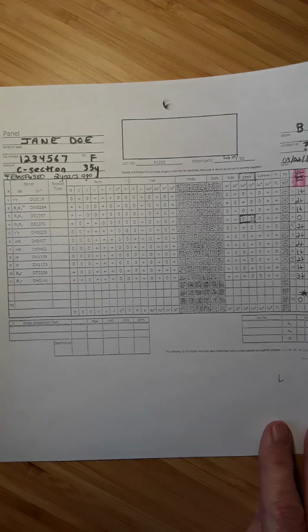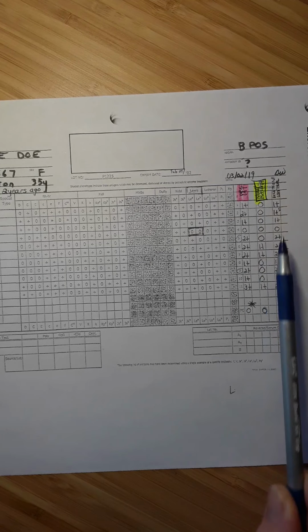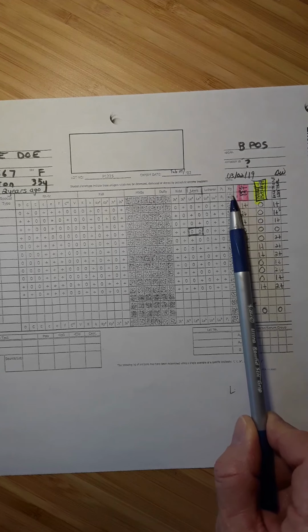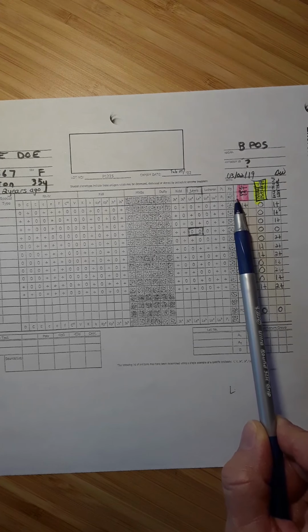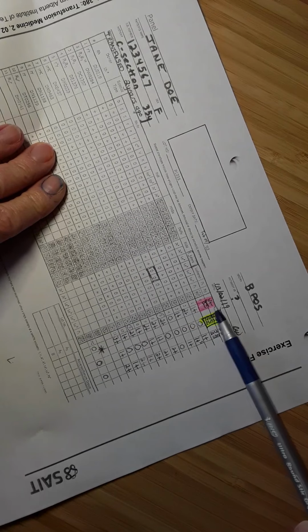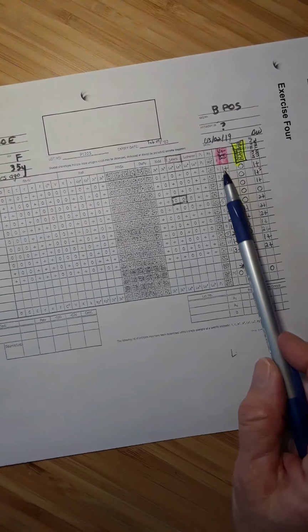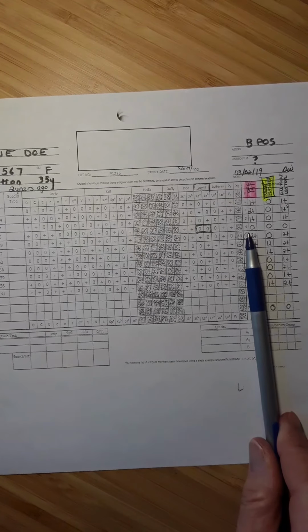So let's look at the reactions that we got for the panel when we ran it with PEG by IAT. I've got 3 columns over here of patient results, and I just want you to look at this PEG IAT. You might not be able to read my writing there, but it's written sideways, and it says PEG IAT. So just look at this column, because when you run a panel, that's what you're running. I haven't done these 2 columns yet. I've only run the PEG IAT.